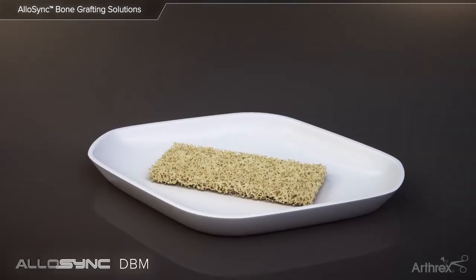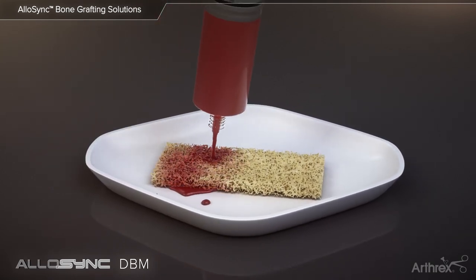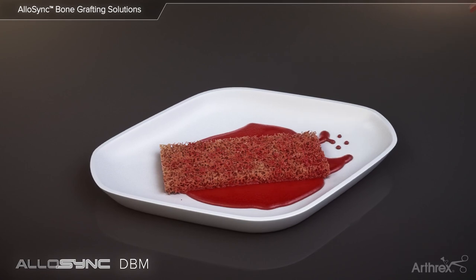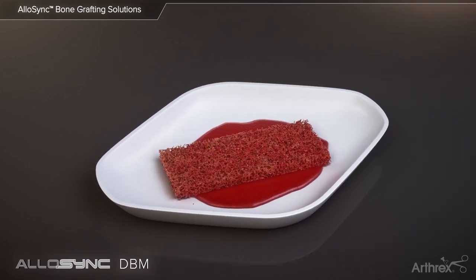The Allosync demineralized cancellous sponges and cortical fibers can be hydrated with bioactive fluids such as platelet-rich plasma or bone marrow aspirate. During hydration, the graft will naturally wick up and retain the surrounding fluid, making it an ideal scaffold for cells and growth factors.